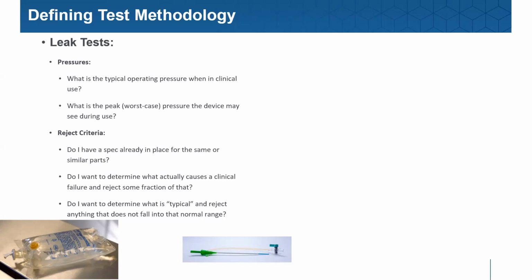If I drill a laser drilled hole through the golf ball sized item that is 25 micron, and I drill the same 25 micron hole through the large tank, if I were to test those at the same pressure, I would see during a pressure decay leak test a massive pressure loss in the same amount of time on the golf ball sized item, because there's not much area or gas in there when it's filled to begin with.